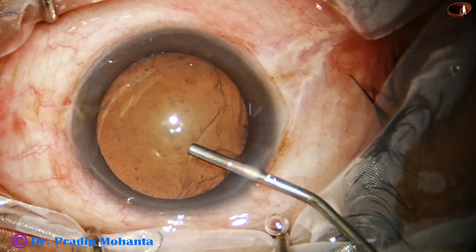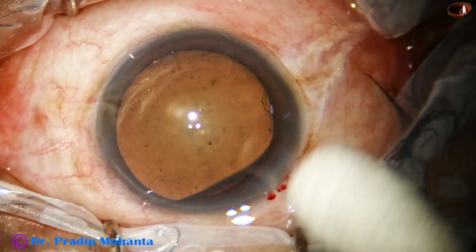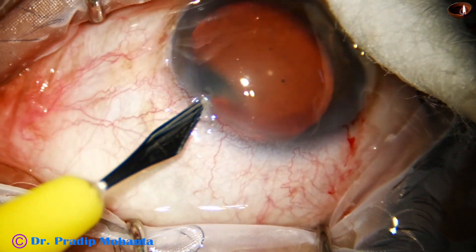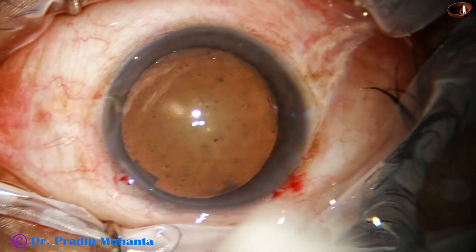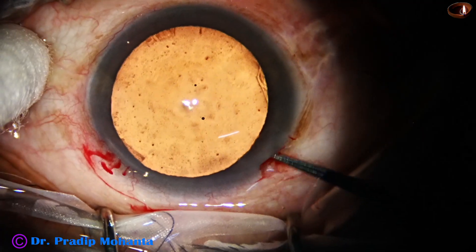This is a soft cataract. In soft cataracts where you cannot hold the nuclear mass with vacuum, this is one of the good techniques. The side port is made, and the width of the side port is about 1.7 millimeters.